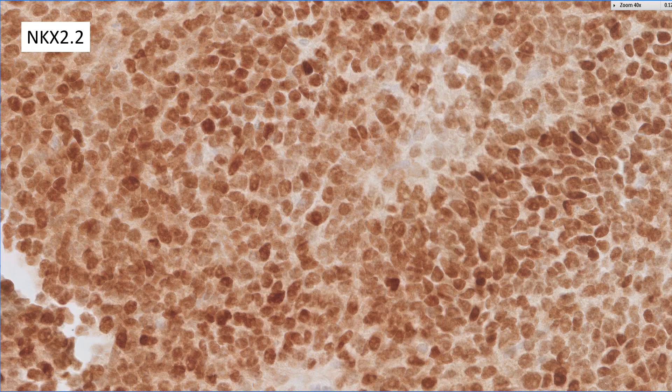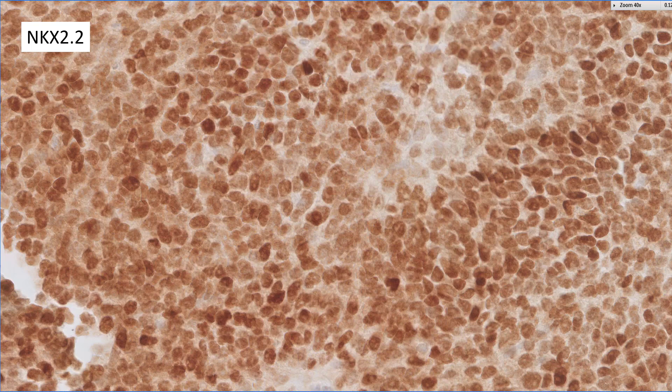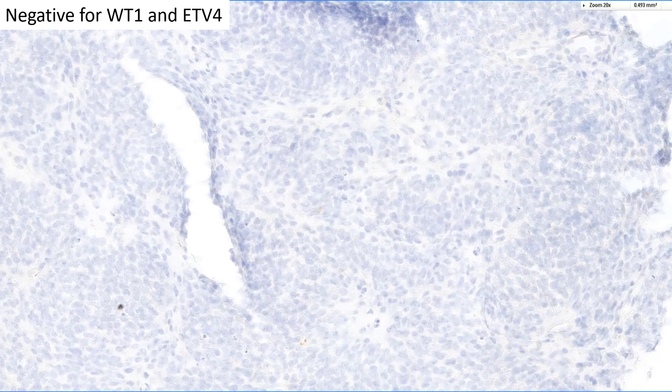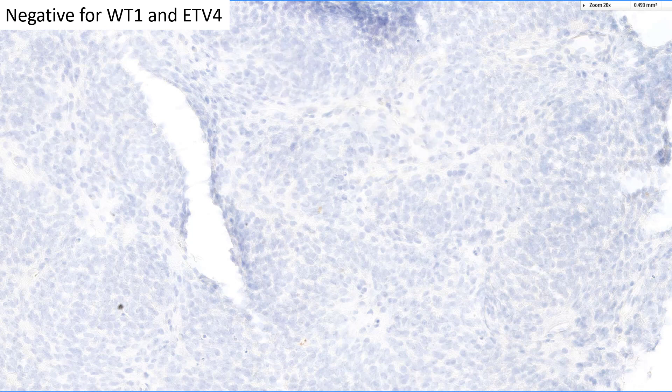When you see that diffuse membranous pattern of CD99 staining, your next stain should be NKX2.2 — strong nuclear staining. Like many other markers, it is not specific for Ewing's sarcoma, but extremely helpful when positive. Once you have diffuse CD99 and NKX2.2 positivity, there are very few other things this could be; this is most likely Ewing's sarcoma provided your morphologic context is appropriate. WT1 and ETV4 will become relevant in other contexts, and were clearly negative in this case.